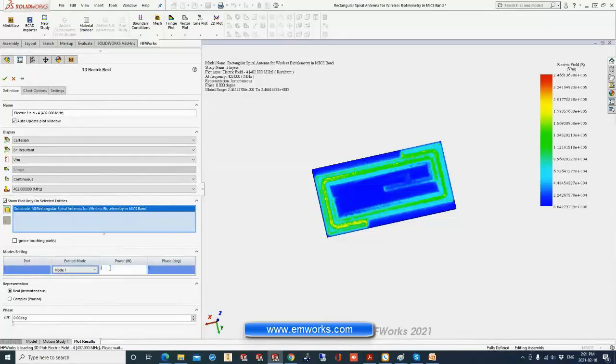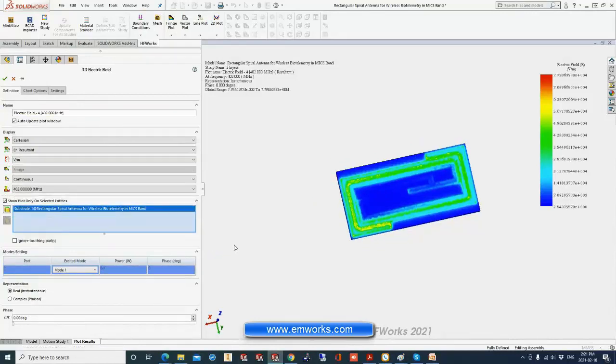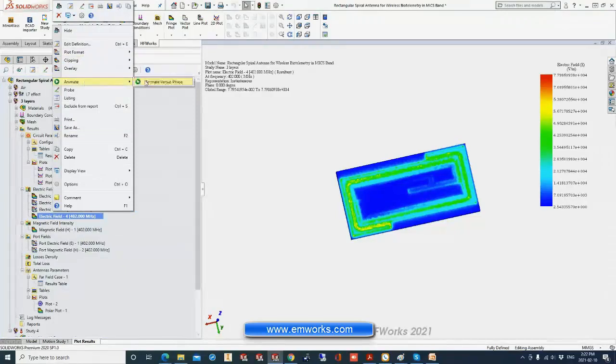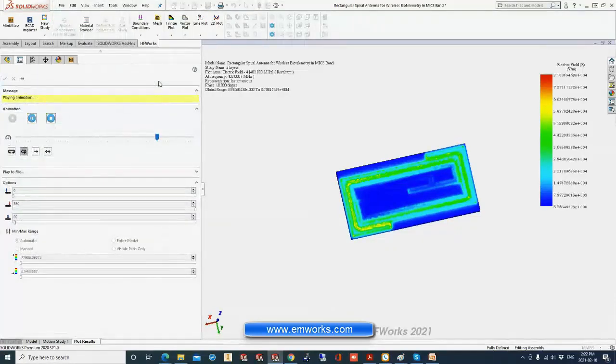I can actually control the input power. One, for example, and the electric field is adjusted automatically. If you have more than one port, you can also play with the phase. You have the weight and the phase of each port. You can also animate the electric field versus phase to see the propagation of the wave.